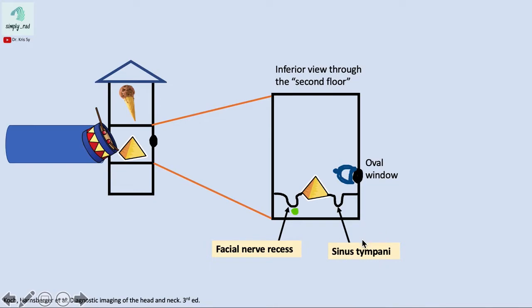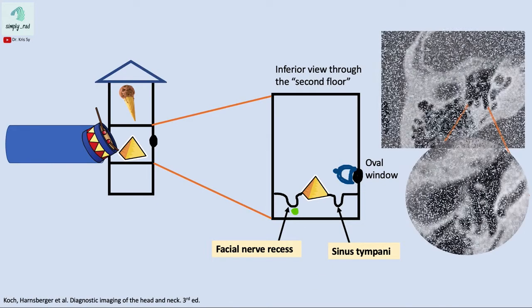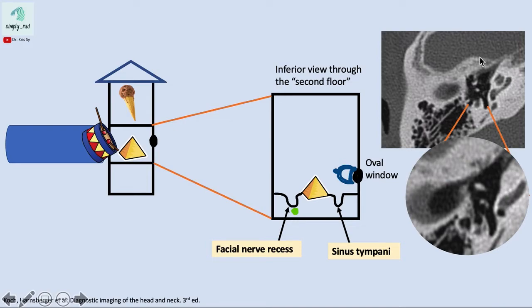Here is an axial image — can you see the stapes? There's the stapes. Following these depressions inferiorly, we see the pyramidal eminence, a depression laterally which is the facial nerve recess, and another depression medially which is the sinus tympani.